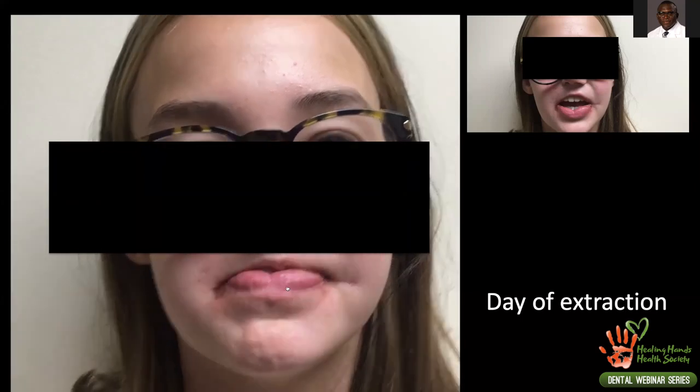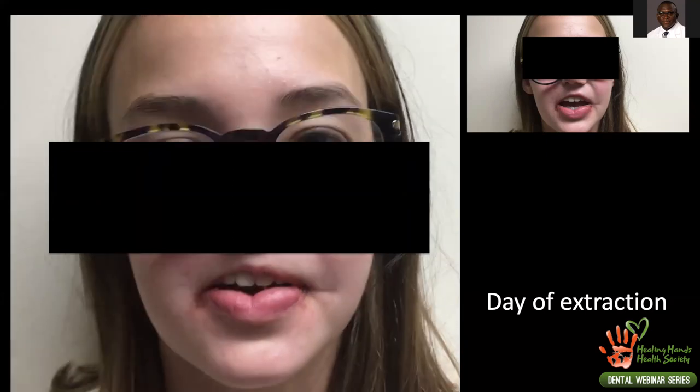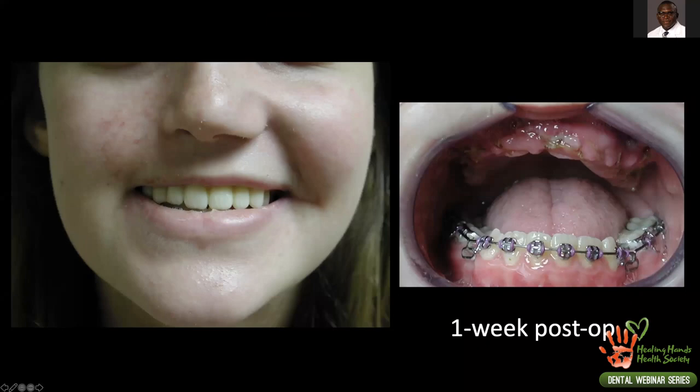This is the day of surgery — she just had her upper teeth extracted. You can see how swollen she is, yet the denture has good fit and good suction. At the one-week follow-up, when swelling had resolved, you can see how the teeth look. She liked the teeth, the shape, and the size. She started college without any major complications and wore the denture successfully.